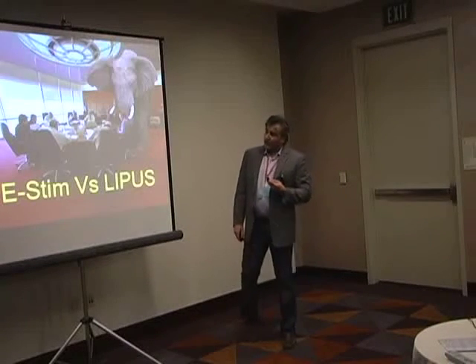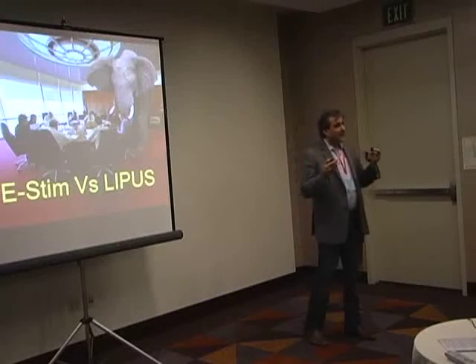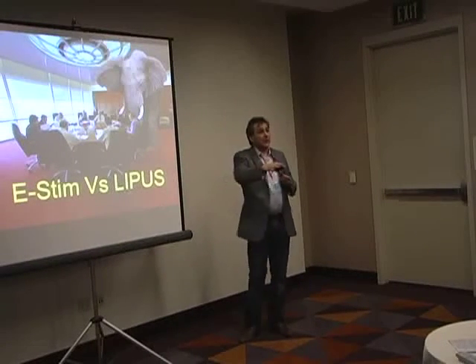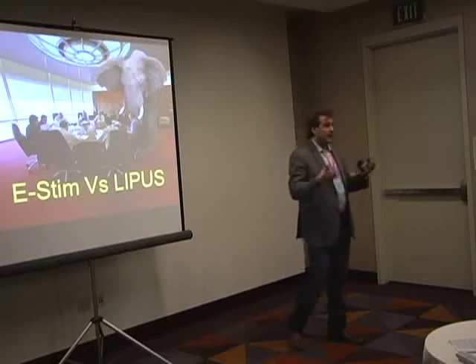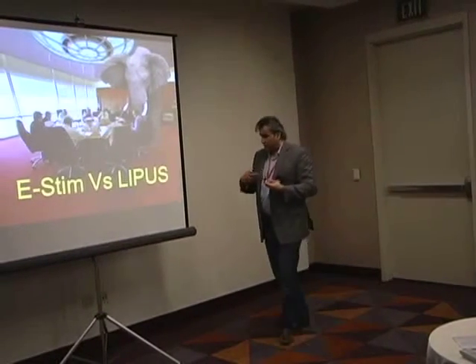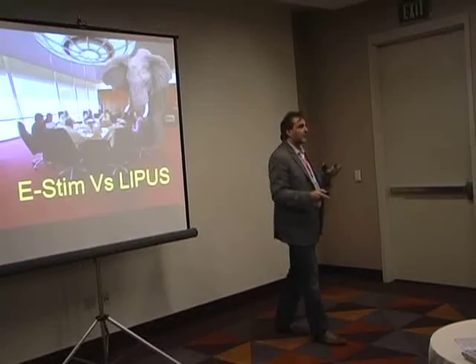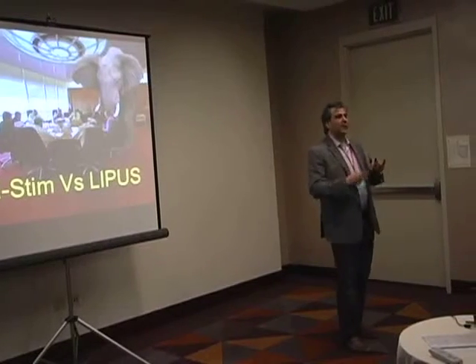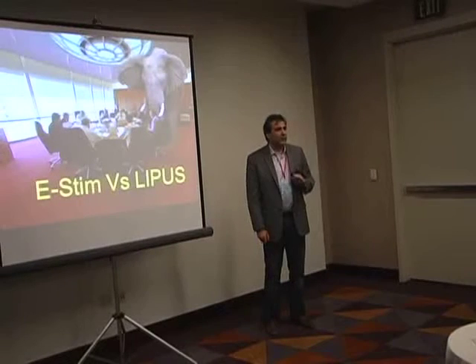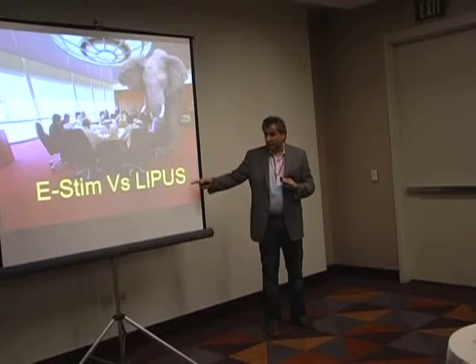And now, because there are newer techniques, you can actually take independent groups. So eStim versus LIPUS would be the ideal study. The question we'd like to ask is, which one do you use? Do you use LIPUS or do you use eStim if you're going to use a bone stim in general? Despite trying, we were unsuccessful in getting an eStim company and an ultrasound company to agree to randomize their products against each other. And you can imagine why that would be a challenging marketing tool if one of the trials showed no difference, or in fact showed inferiority of one to the other.